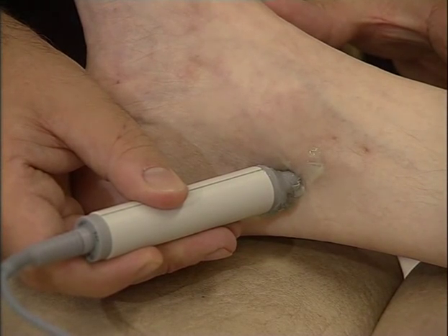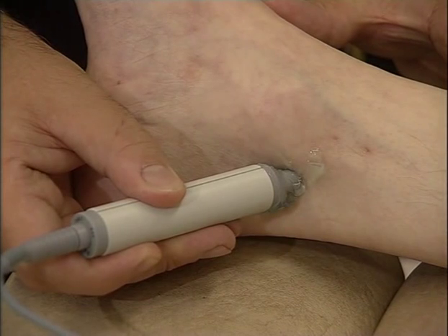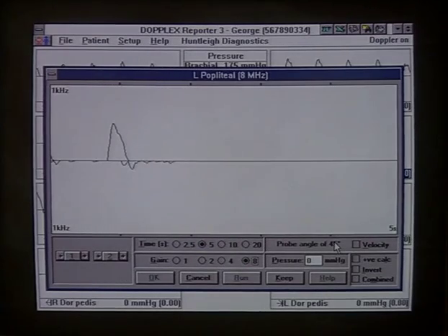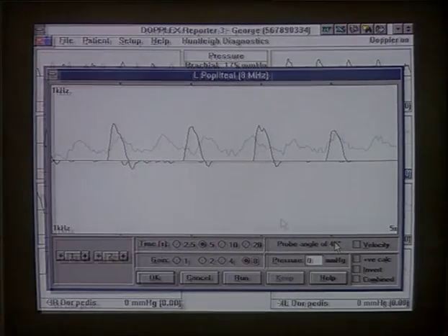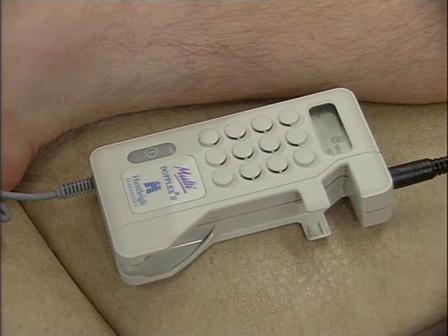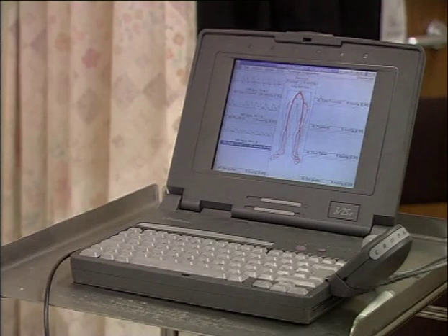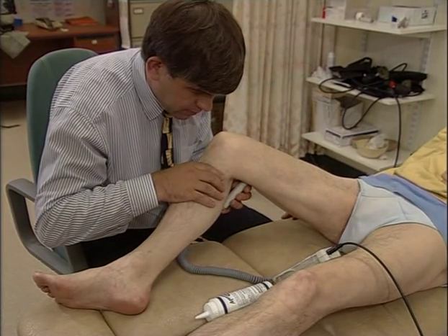Arterial disease will influence the waveform in a number of ways. For example, the restricted flow of blood from a stenosis creates a change in the waveform shape with a reduction or loss of reverse flow. As the degree of arterial disease increases, the waveform becomes increasingly damped or flattened. Using a bi-directional Doppler, a PC with waveform software, and a printer, it's possible to carry out a sophisticated arterial assessment of the lower limb.